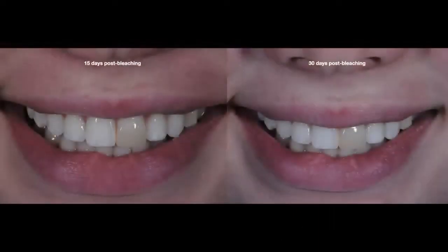But what I want you to know first, and the question that I always ask myself, this was a very young patient, a lot of white spots. If I want to make this easy on me, I've got to get rid of those white spots. Because if I don't get rid of the white spots, the patient must be informed that if I am going to reproduce nature with my ceramic restoration, I'm going to have to add those white spots to my final restoration.